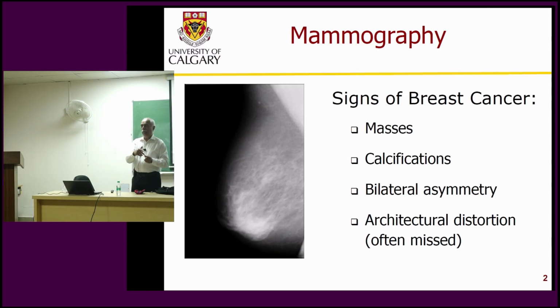So again, women were afraid or concerned that I go there and then I have to go for additional tests, and then at the end you're told, well, everything is okay. So that kind of false positive ratio in mammography itself made mammography a bit difficult to accept and for the screening programs to be successful.